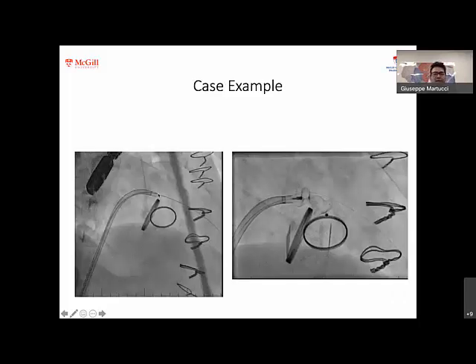And what you can appreciate is that the mitral valve is in plane. This is the aortic valve. This patient also had two mechanical valves. The mitral valve is in plane. The leak is in the superior aspect of the mitral valve, as best seen in the two-chamber view, both on echo and on fluoroscopic imaging and on CT imaging. And then once you've identified the leak in the superior aspect, it's actually quite easy. We cross the valve with a wire. We put in a device. In this case, we chose to use the AVP3 device, and we proceeded to close the leak in that fashion.